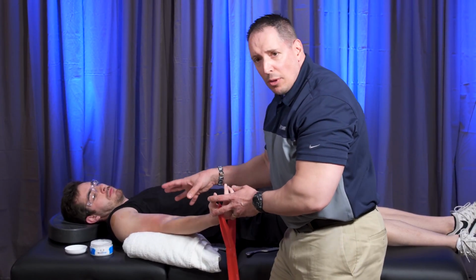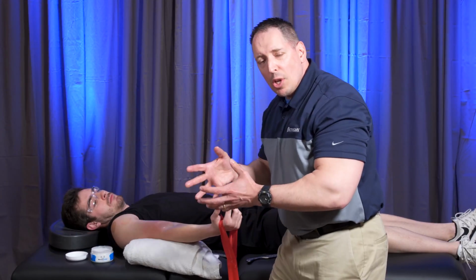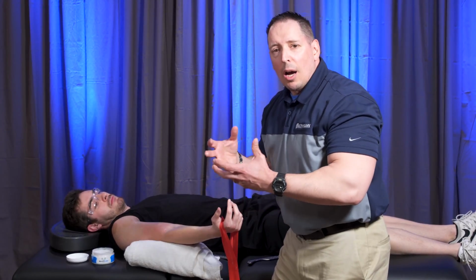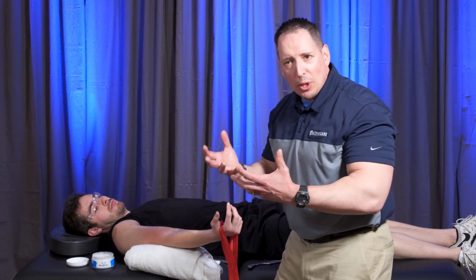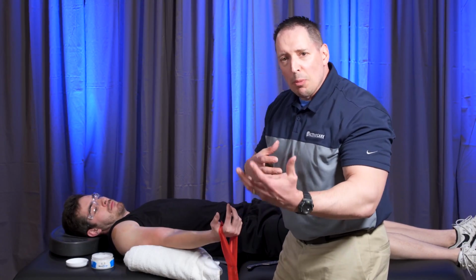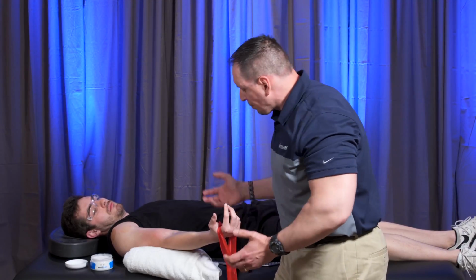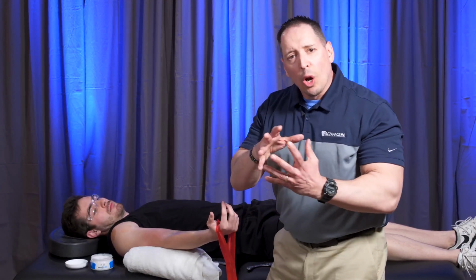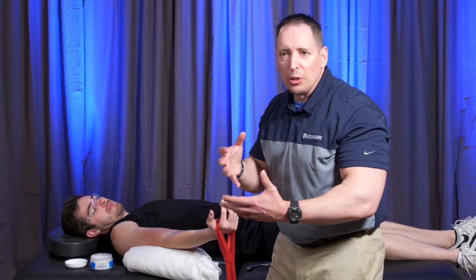So what happens is after we've done the treatment, we go ahead and initiate function afterwards, because there's no sense in mobilizing something and not moving it functionally afterwards. We have to incorporate a therapeutic activity into our instrument-assisted techniques, mobilizations, or whatever we're doing, okay? And once we've done that, we can do our pre-test and post-test and document our improvements in the patient's range of motion and reduction in pain.